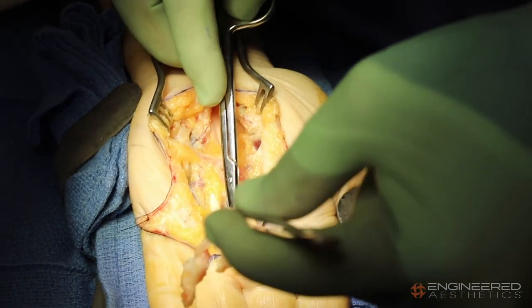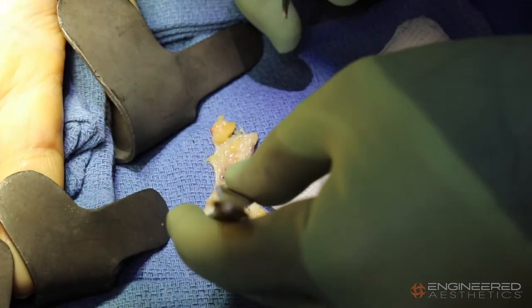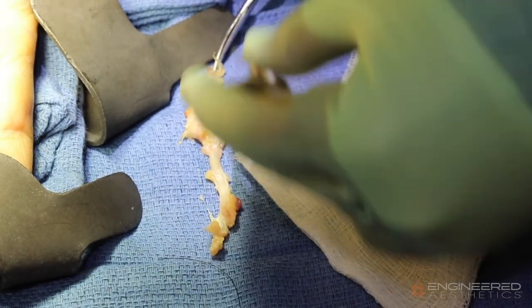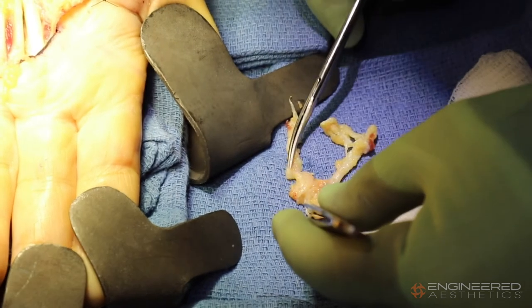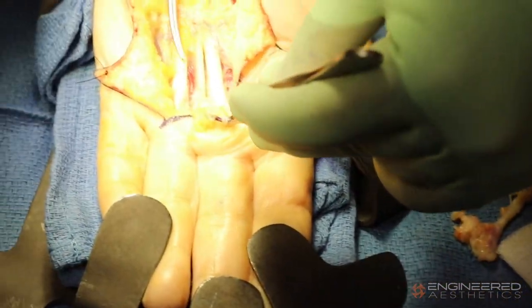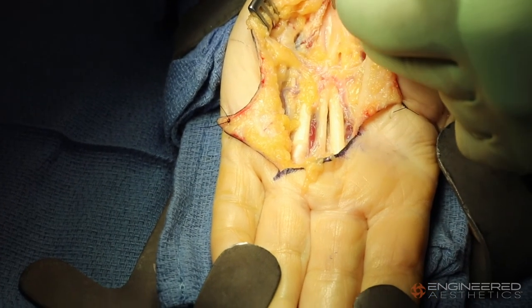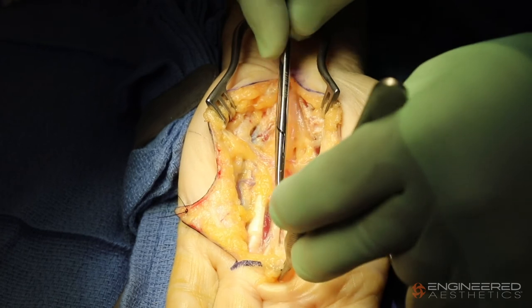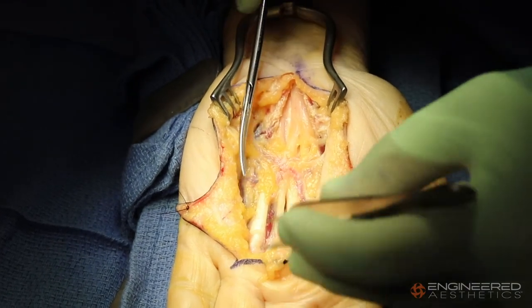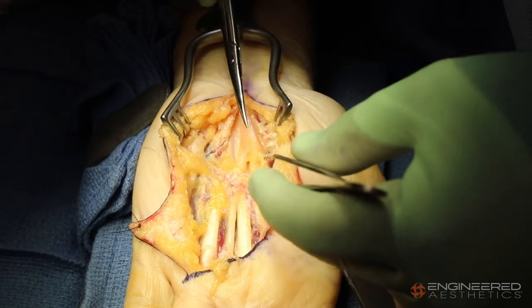There we go — the last remaining fibers that are holding on. I was actually able to remove both digits with a parallel dissection, so imagine that was the normal orientation of how that cord was in the palm of this patient's hand. Now you can see that the entire flexor tendon sheath and the digital nerves have all been preserved and protected. The vascular arch is protected. The median nerve is protected — here it is arborizing to give branches off to the ring finger and the middle finger. This is a common digital nerve and you can see where it splits. Beautiful anatomy.